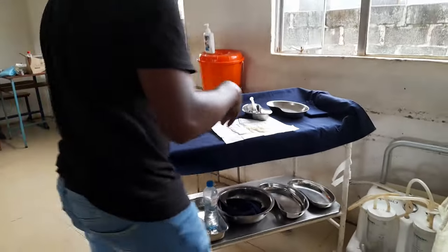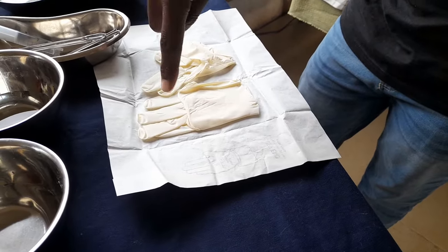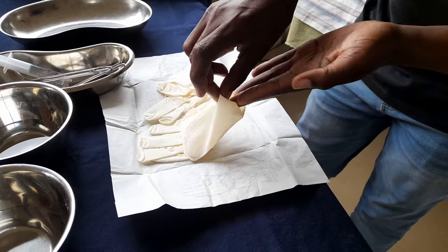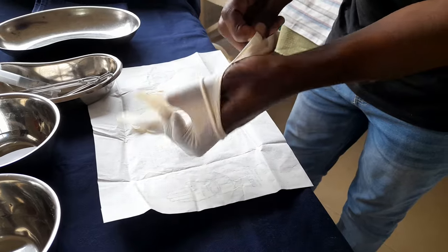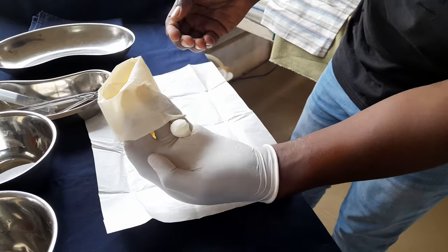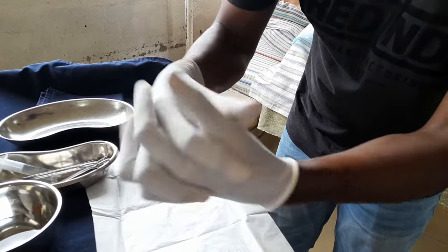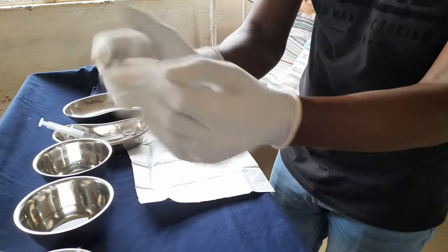Now don your sterile gloves. The outer part of the glove is sterile — do not touch it with your bare hands. Touch only the cuff area. Slide your fingers in, pull, then pick up the second glove by touching only the folded cuff. Insert your fingers and correct the fit. Once both gloves are on correctly, the sterile field is maintained and you can proceed.